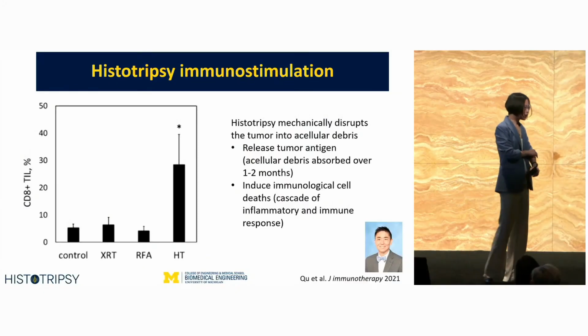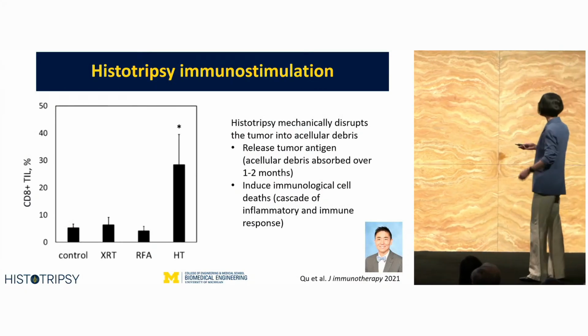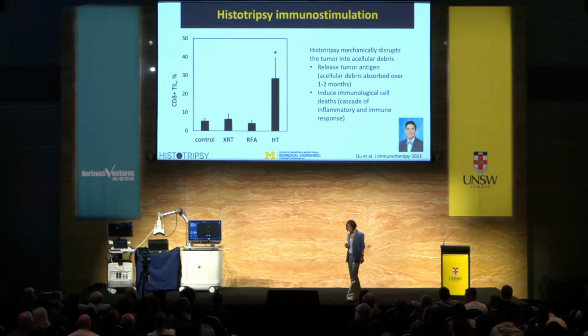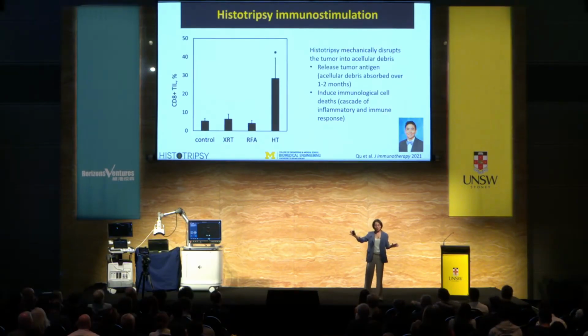And I want to talk about the wonderful discovery later, which is that histotripsy stimulates the immune response, which is what I did not anticipate at the beginning. It was a wonderful discovery along with Dr. Cliff Cho, who is a cancer immunologist. So what we found is that histotripsy is a very unique interventional technology. Unlike radiation, which uses ionization, or ablation like radiofrequency ablation or microwave ablation, which are forms of ablation technology using heating, right? Different energy, even using laser or ultrasound.